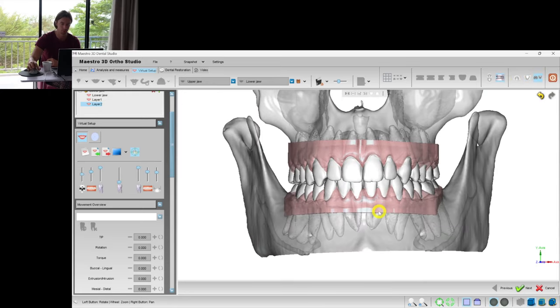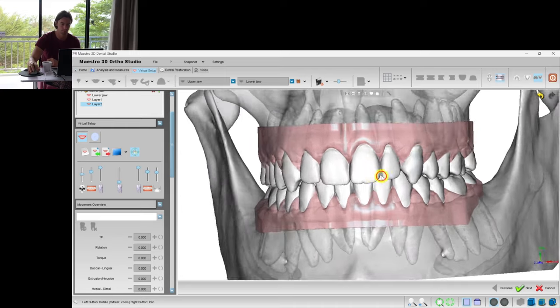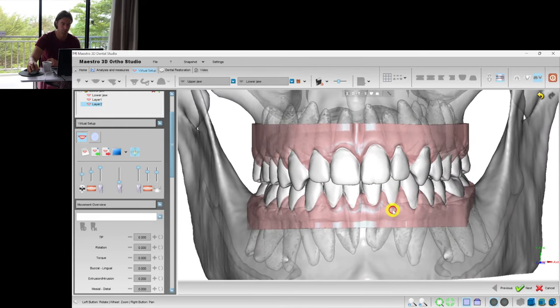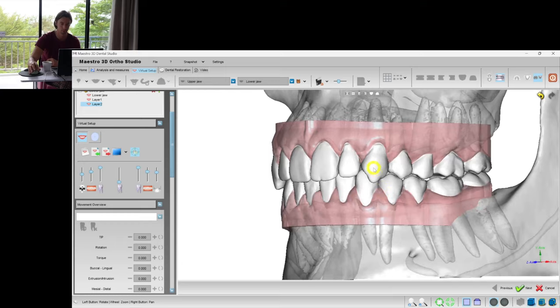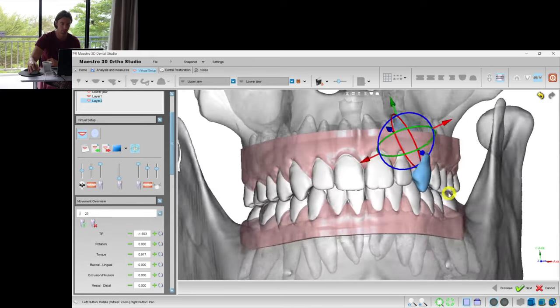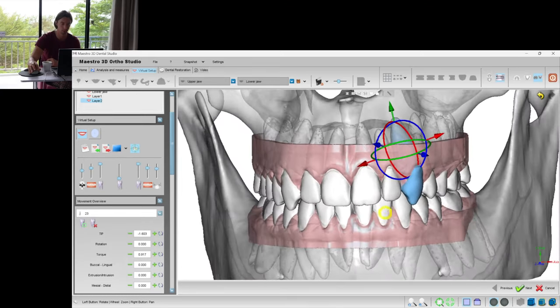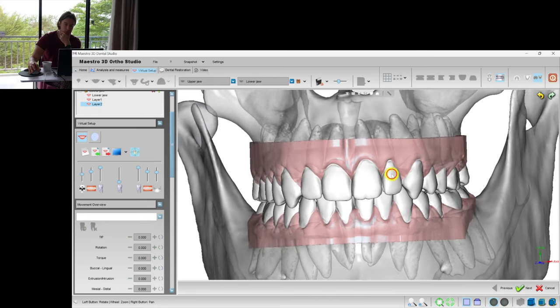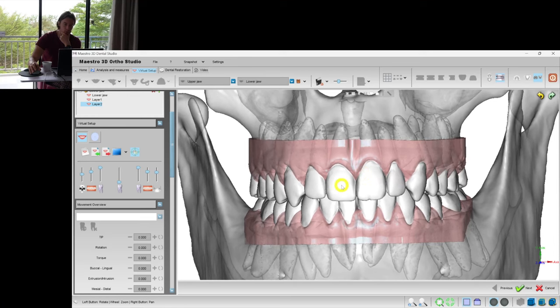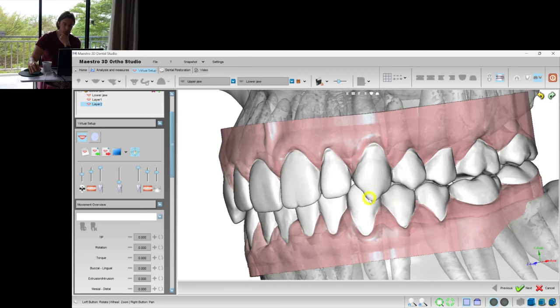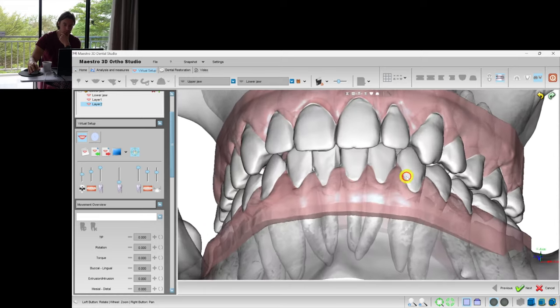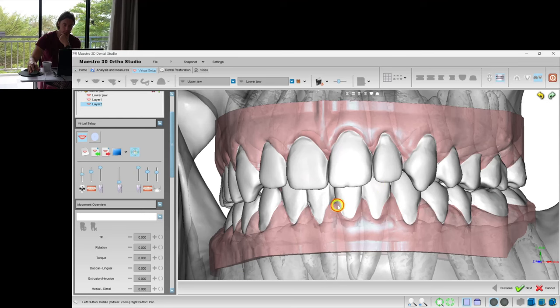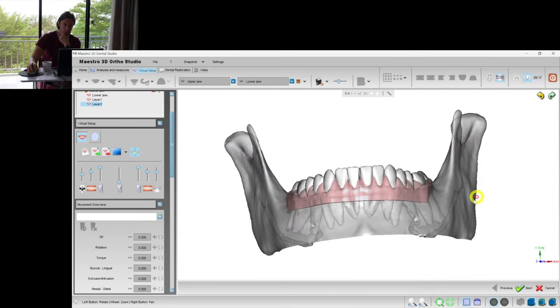Let's adjust the vertical positions by adding some intrusion as well. Maybe we should intrude the canines, but it's a very complicated movement for clear aligners, so I would better consider some grinding of the incisal edges of the canines because they are too big. This is what I usually do.